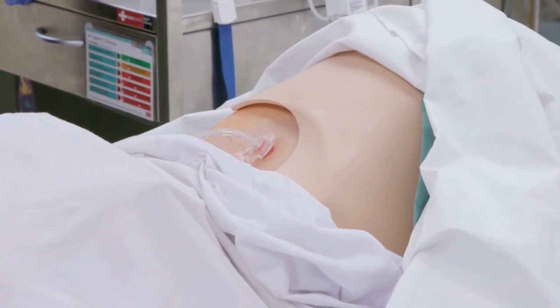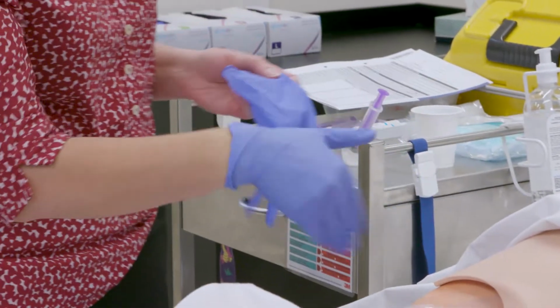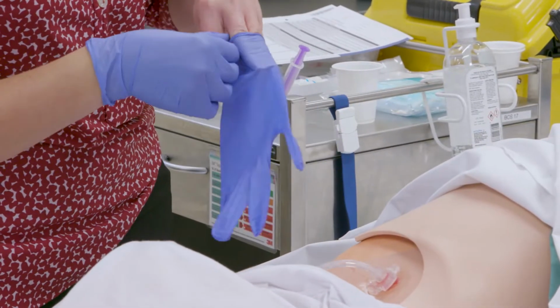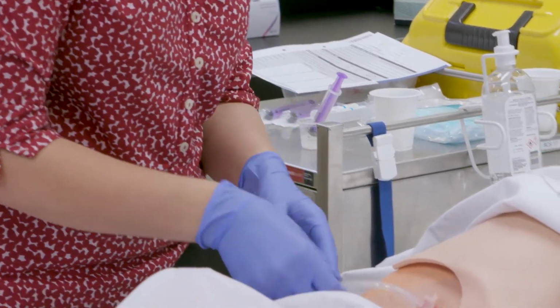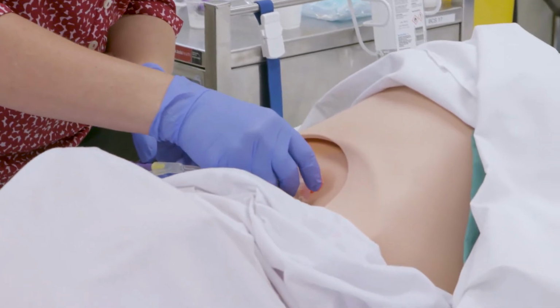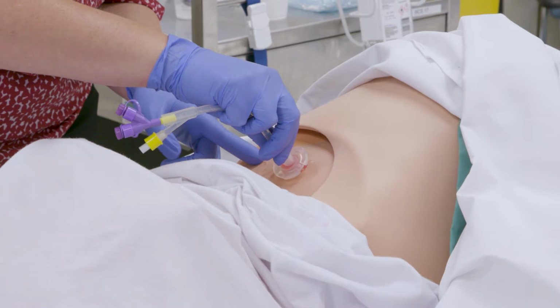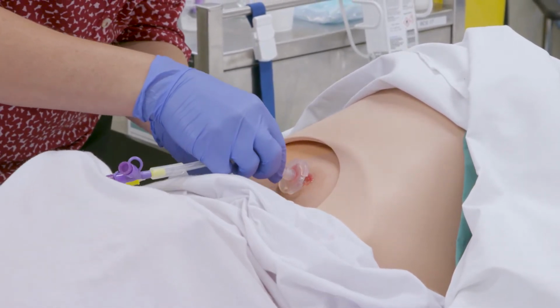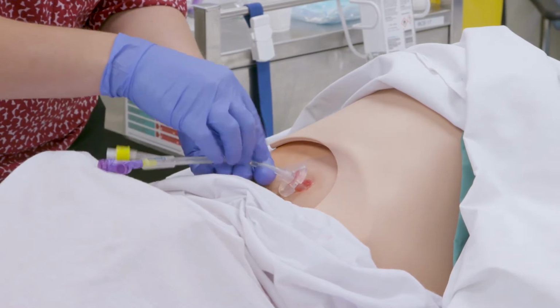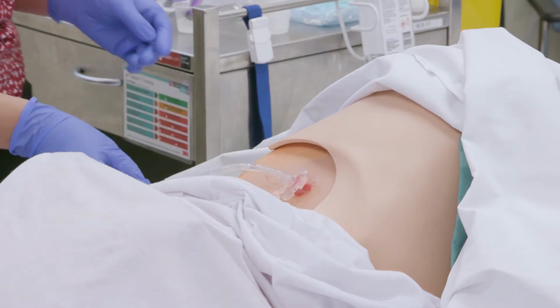Okay, some gloves. Okay, you can see that the tube has got some redness around it. That's normal as long as there's no haemopus or infective ooze that's coming from the site. At this point, you want to make sure that the tube is free, can be rotated once. Okay. Position, where is the tube positioned? You can see that here it's located at 4 centimetres, and you would document that within your notes.